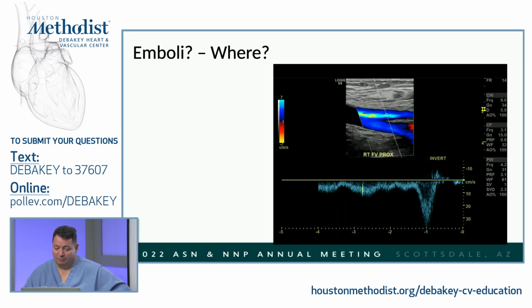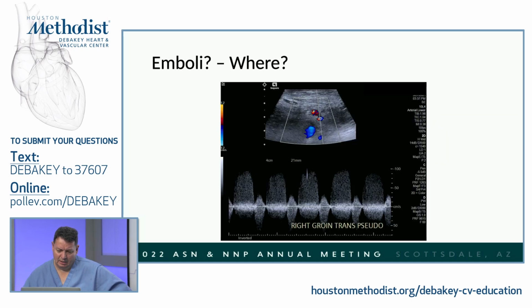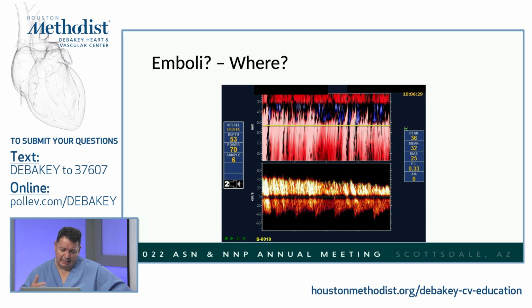And my second beautiful example, this is a leg venous duplex, right femoral vein. This is a bubble. Cool. So thank you for that question. And another thing that's very interesting, this is again an IJ, and this was captured during our vasospasm protocol in the NICU.